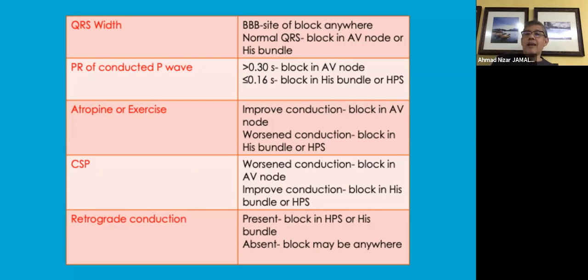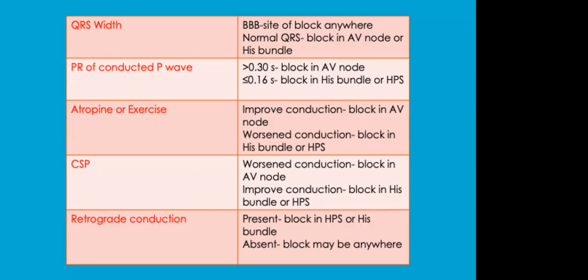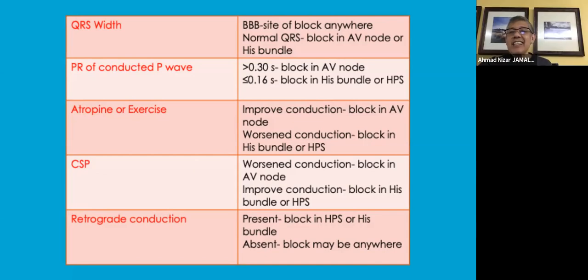2 to 1 block, yeah. So you need to do this carefully, yes. But you can tell the difference. I think as a house officer, please don't do it on a patient with AV block. That is why exercise is the best way to do it, right? Yeah. The patient is stable.